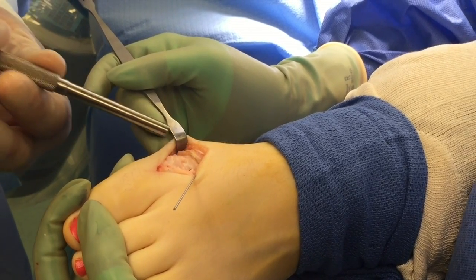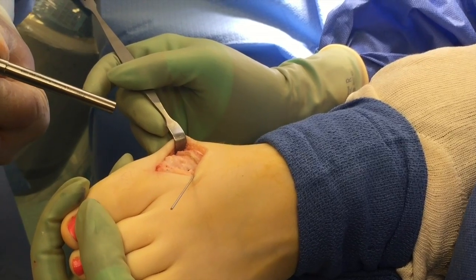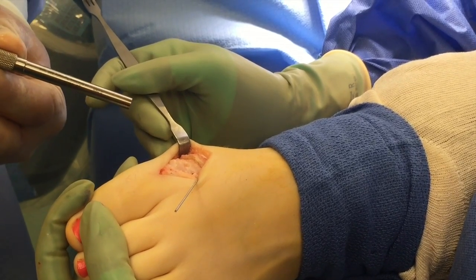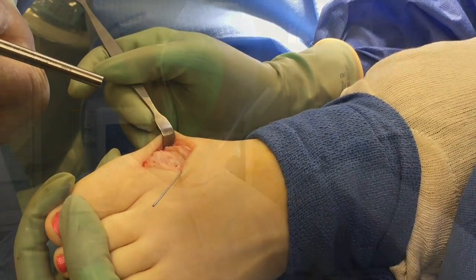After we clean this up, remove this edge, smooth this out, and close her, she will be straighter. The osteotomy will be healing with the natural product, and no hardware will be in there or have to be removed later.